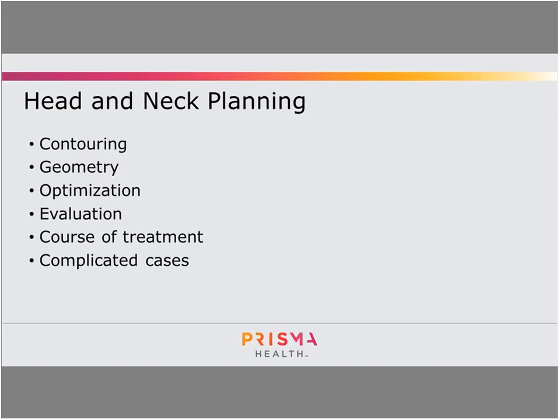So for instance, when a patient does lose a lot of weight around week 4 or 5, like what do you do with that? Do you have to replan? Can you continue? How do you evaluate that? So sort of that decision-making process. And then I put complicated cases on there, just sort of like retreatment, things like that, when you have to make decisions that aren't really common.